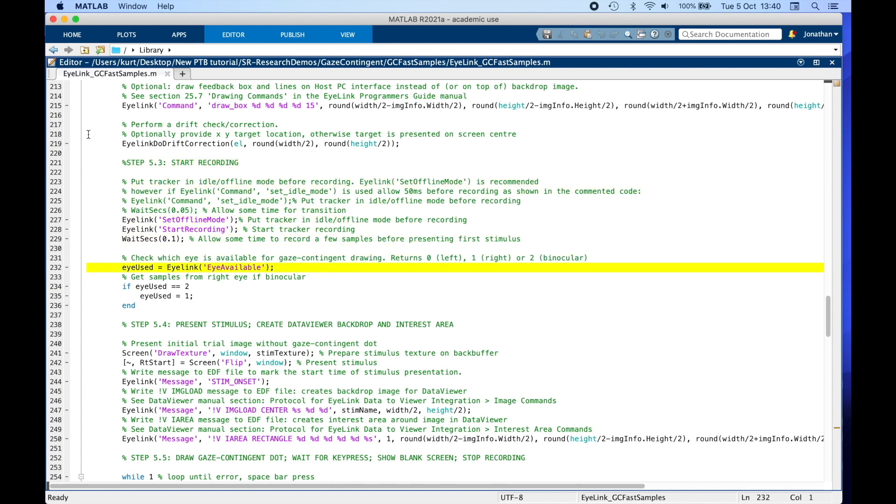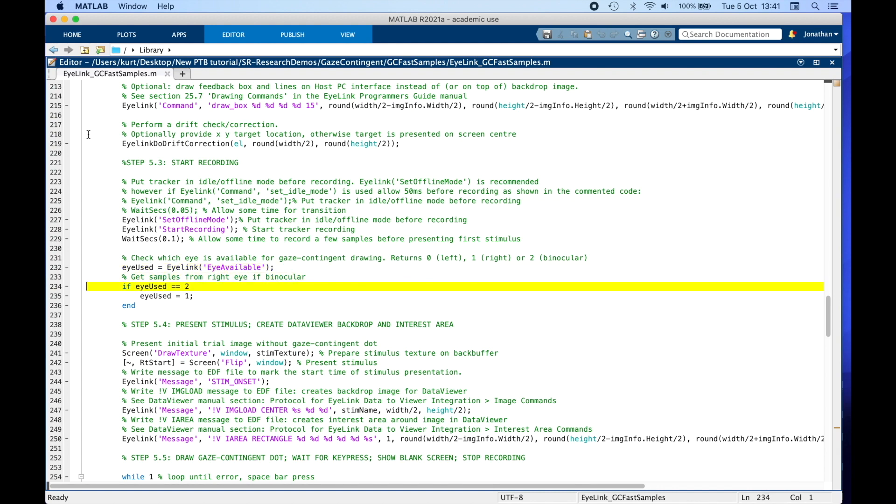This demo first checks which eye is being recorded. When we call EyeLink EyeAvailable, it returns 0 if the left eye is being recorded, 1 for right, or 2 for binocular tracking. If we are recording binocularly, this demo retrieves monocular data anyway by updating the eye used variable value to 1.